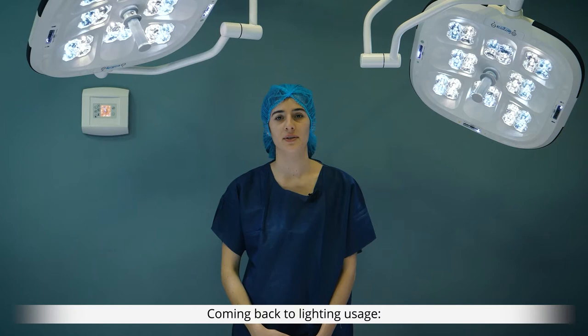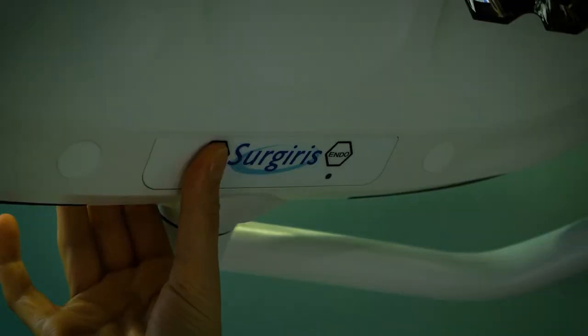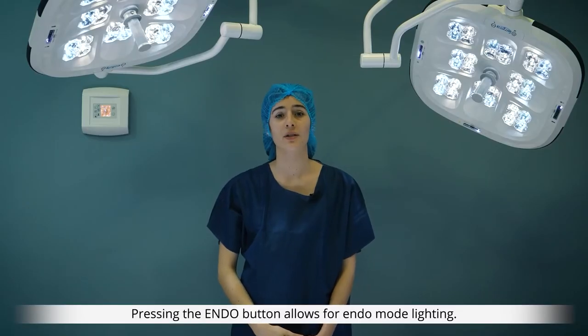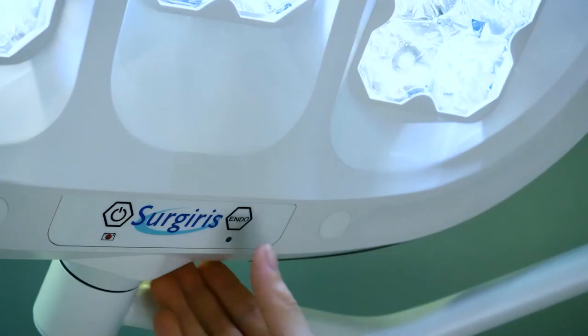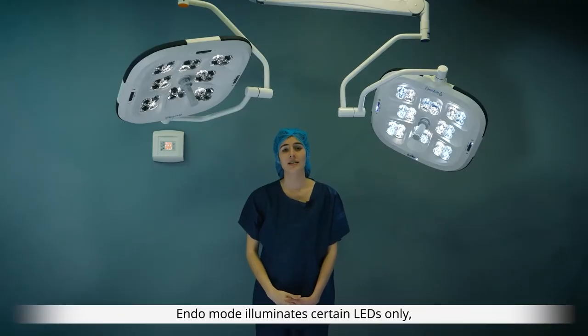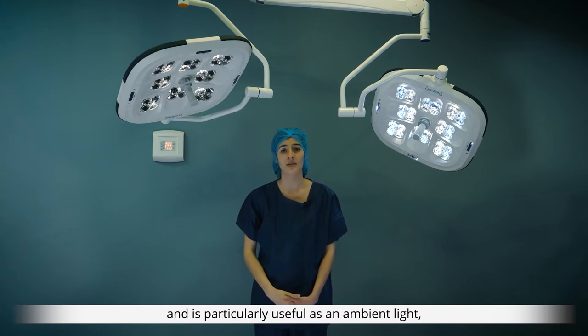Coming back to lighting usage, you can switch the light on or off here. Pressing the endo button allows for endo mode lighting. Endo mode illuminates certain LEDs only and is particularly useful as an ambient light suitable for endoscopic or laparoscopic procedures.